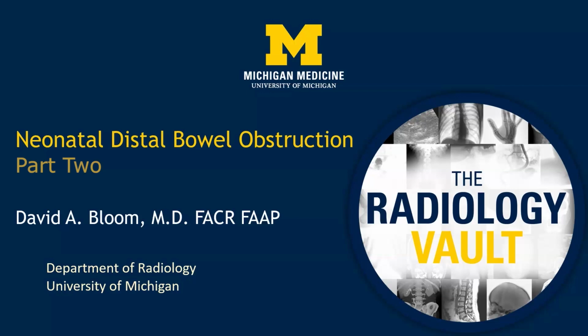Hello, my name is David Bloom, and I am a pediatric radiologist at CS Mott Children's Hospital in Ann Arbor, Michigan. And it is my pleasure to speak to you today about a topic I find very interesting, sometimes confusing and stress-inducing, but I think we can make it as easy as possible for all of you, and that is neonatal distal bowel obstruction.